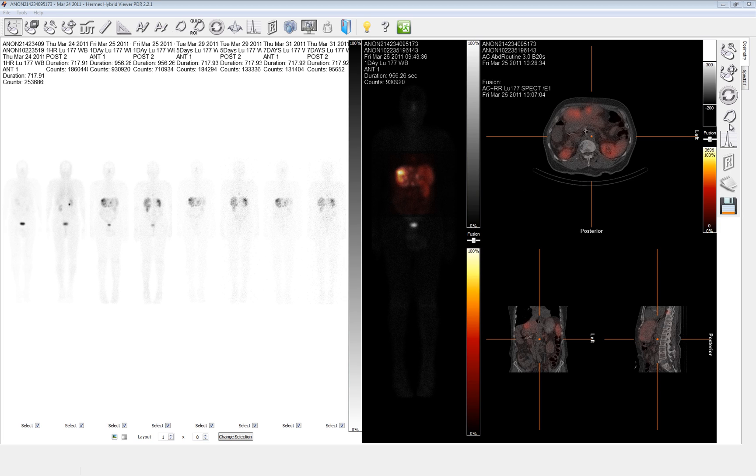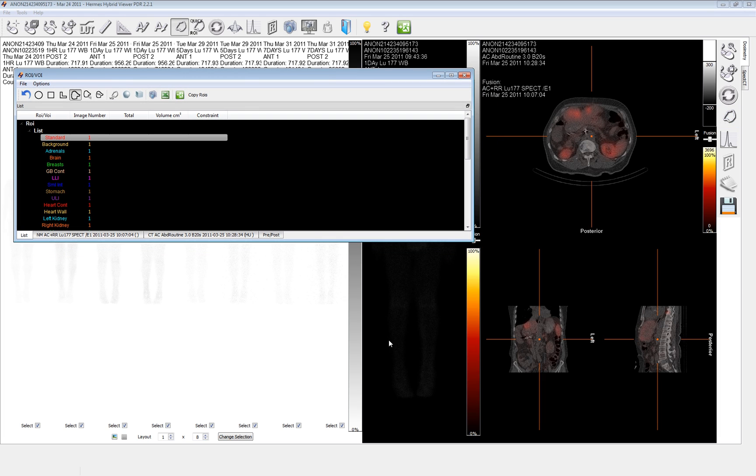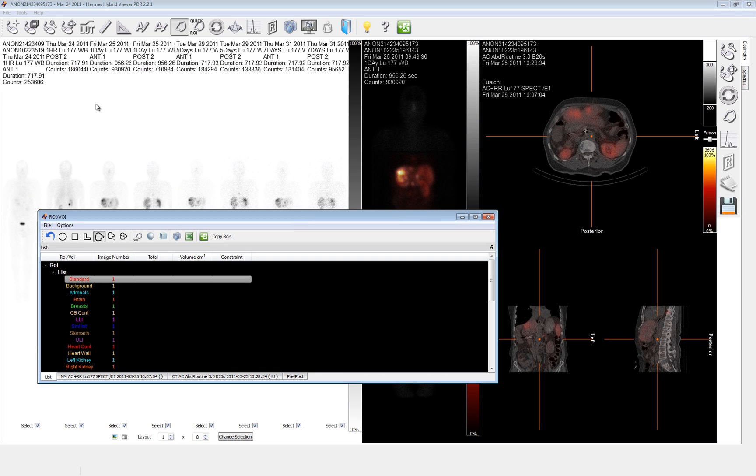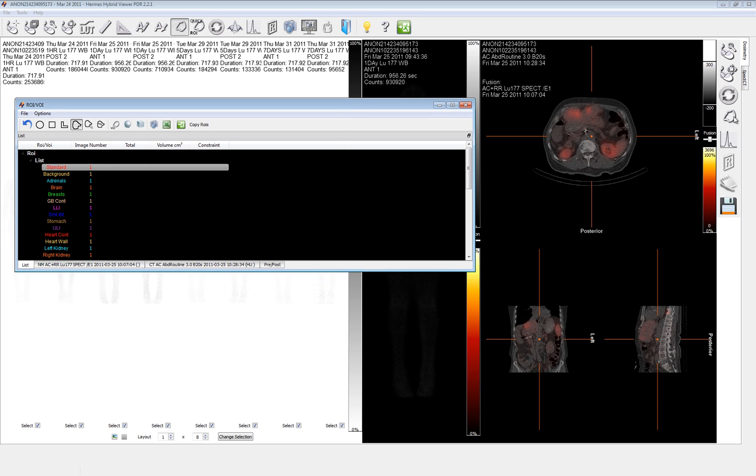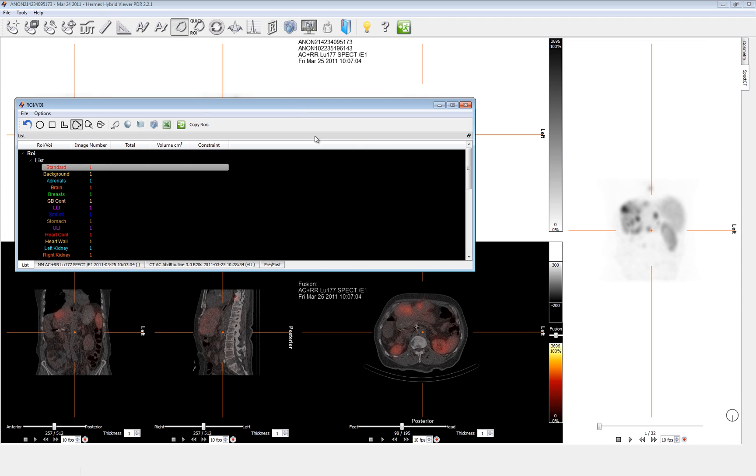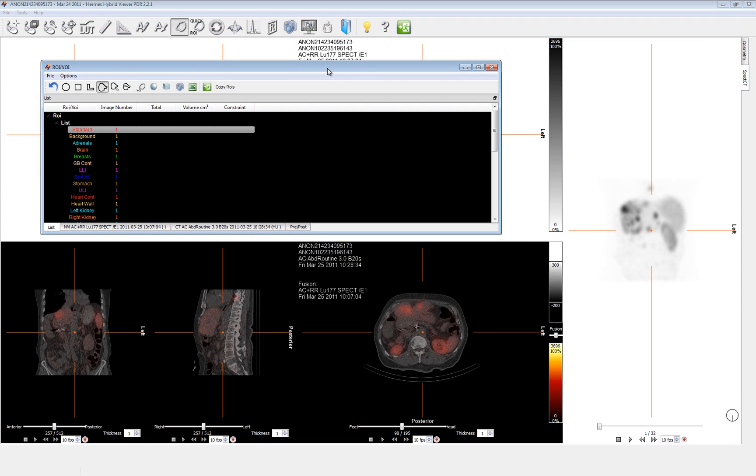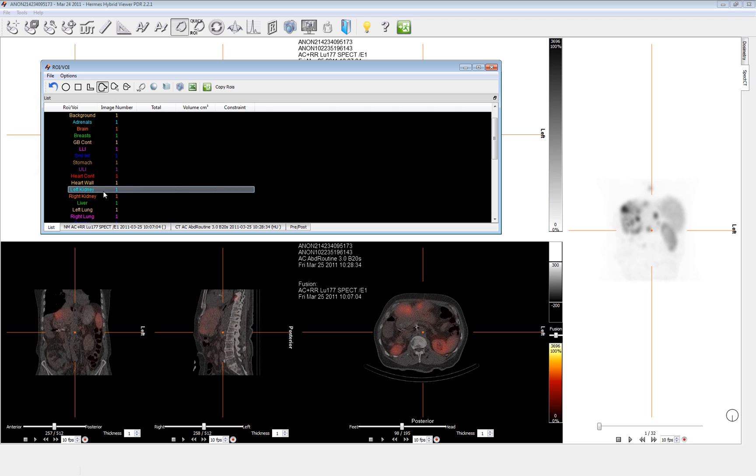So the order does become important. We want to begin by choosing our ROI-VOI tool. This page shows the whole body regions, the alignment, and a small portion devoted to SPECT CT as a fused image. There's another tab with SPECT CT that shows the SPECT in TCS view that's fused with CT, and finally a MIP view of the SPECT. I prefer to draw on this particular tab because as I'm drawing some organ, I can actually see the extent of that in the MIP.